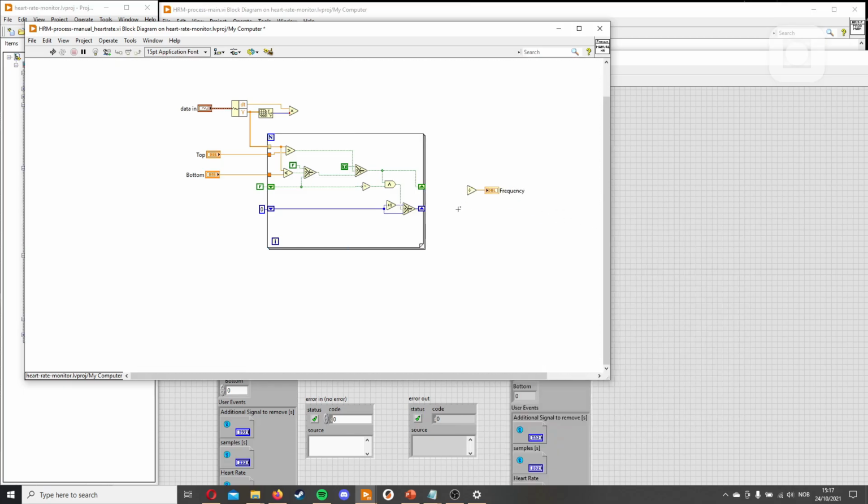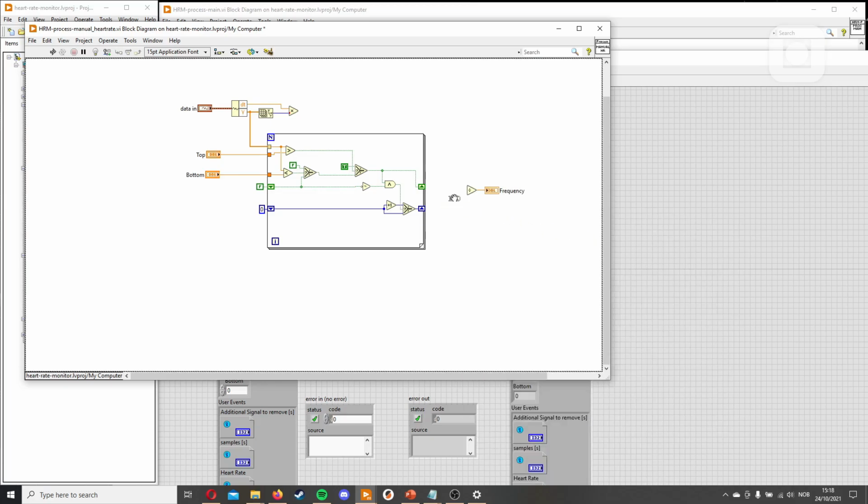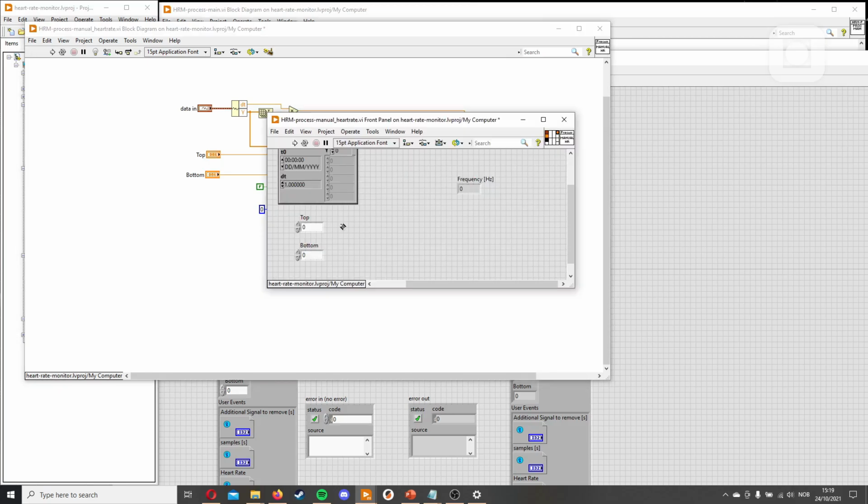So then we'll put this here, and we'll do the conversion since we'll be calculating in double. What we need to do is to get the frequency, we say the peaks divided by how many seconds the peaks are over, and then we get the frequency. We'll just add this here. We call it peaks here for a lack of a better word, but something like a sine wave at 10 hertz would have 10 peaks in a second.